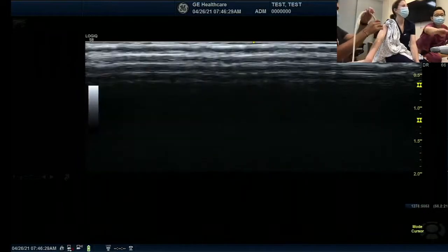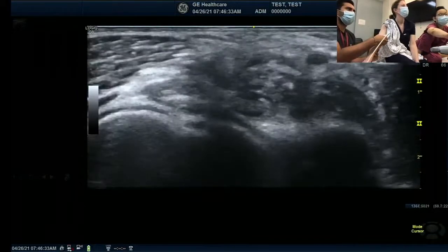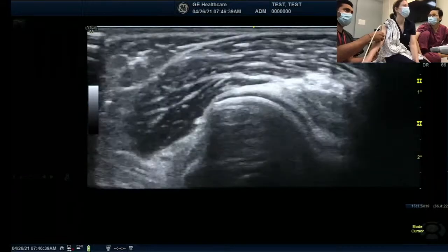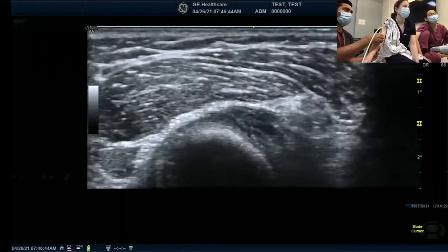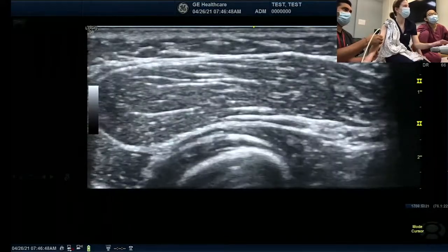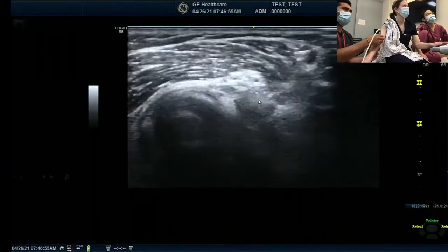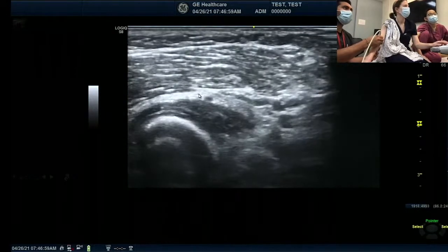The male's nerve is much bigger than our nerve. Let's practice the deeper branch. Maybe the three of us will practice a little more on the superficial branch because we are all different. Davis had the best superficial one. Now you've already passed the arcade of Frohse. I'm going to make it deeper. Maybe Vera will be the one to find the arcade of Frohse.